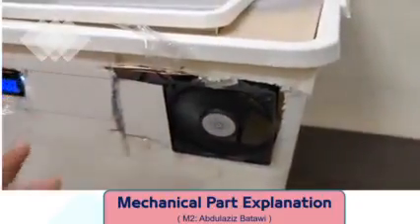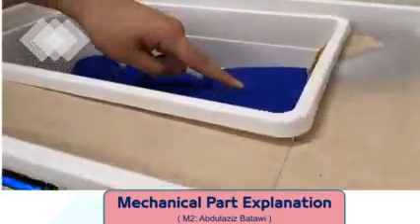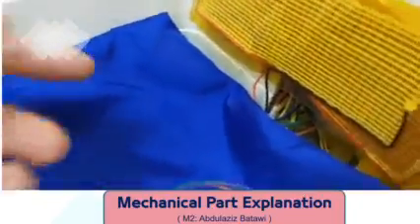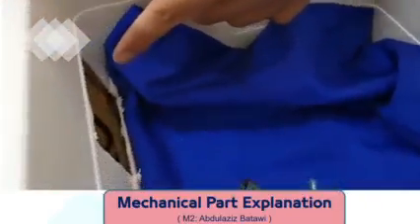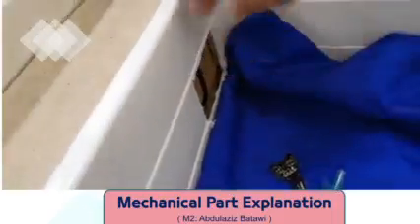So it's going to act as an input that sucks the air from the outside. Then it comes here through the humidifier that carries the water vapor or humidity in order to contain it in this room. Then we have this exterior point for the air to flow in this direction.